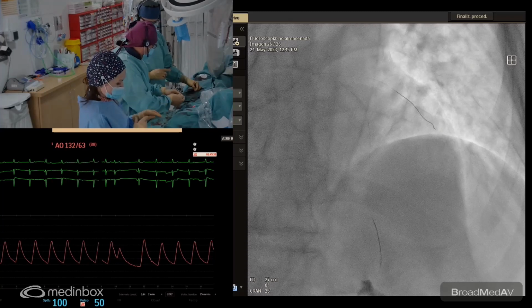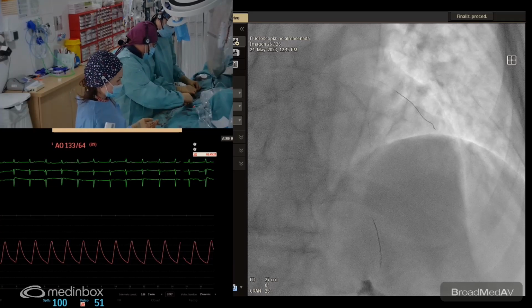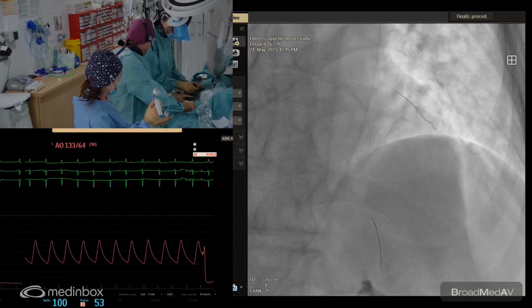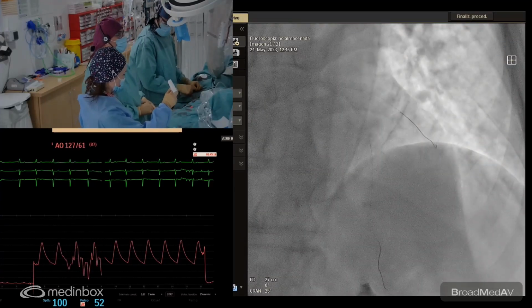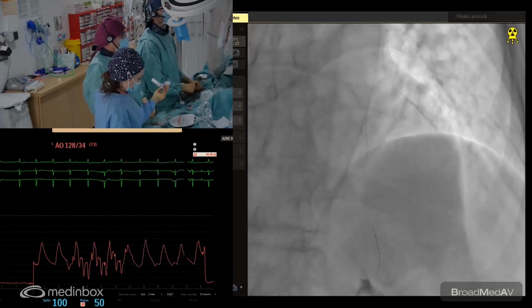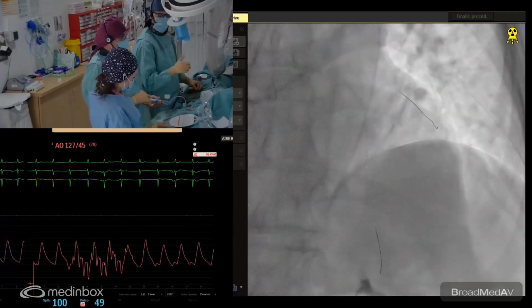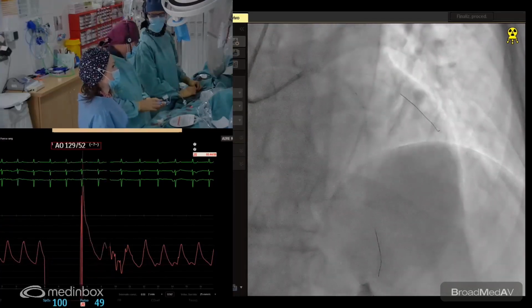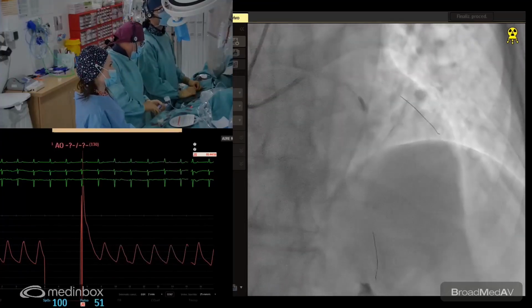We are not doing OCT before or after the lithotripsy, just to save contrast and time. And probably we will check the final result of the stent. And also we see something strange with this dilatation. As you can see, this is the distal vessel, nearly 3.0. And this is the first dilatation we are doing. You have seen the 3.0 balloon has crossed easily.